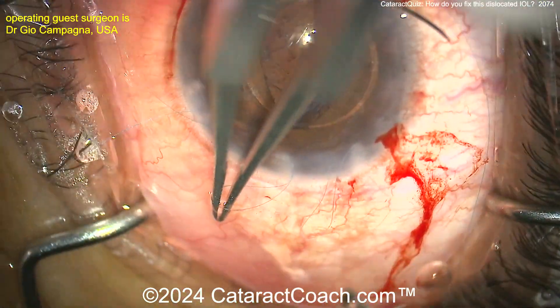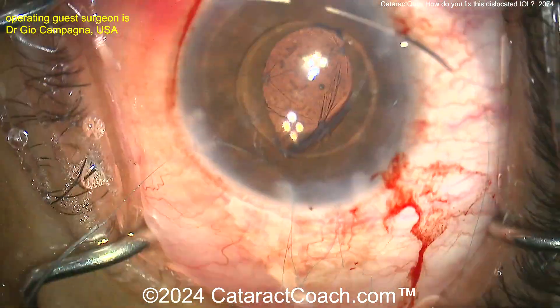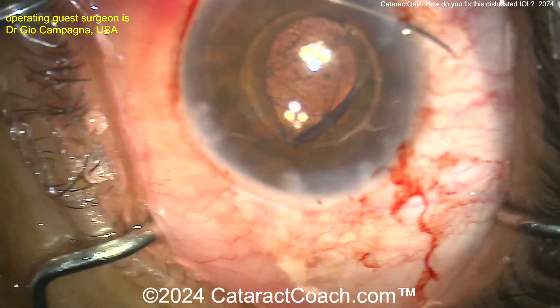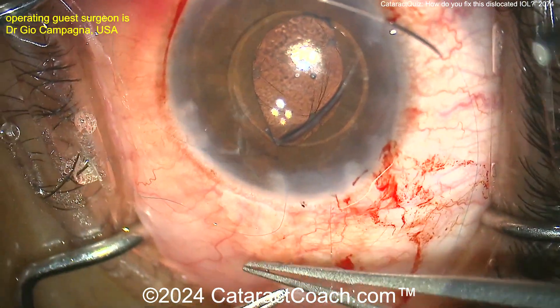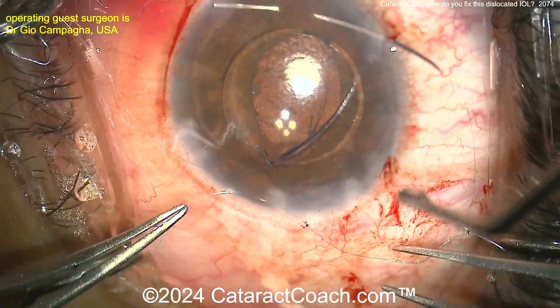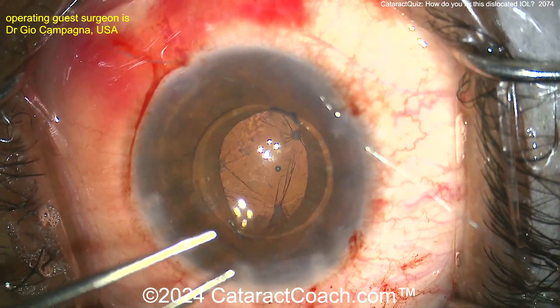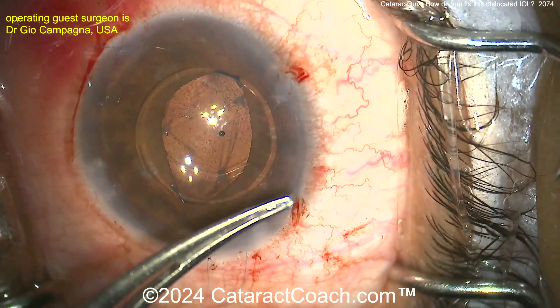How do you do the lens power calculations for this? Interestingly, these sutures aren't going to be quite as tight as you think, and that lens can sometimes be affected by the position of the optic in the sulcus — sometimes it can sit a little farther back in the eye. In general, as you know, myopia is a gift here. If you're debating on whether to lower the lens power, you can keep your original in-the-bag power. If anything, the patient will have a little bit of a myopic shift as the lens sits a little more anterior, but that's okay — we like myopia, myopia is a good thing.